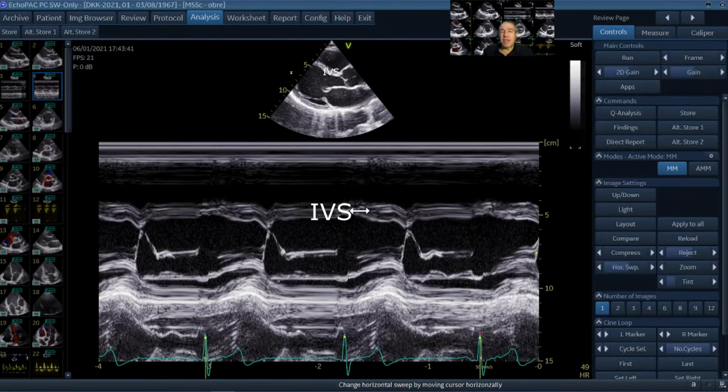You can nicely see the temporal behavior of the septum in end diastole, and then during systole the maximum contraction here. And below you see a part of the mitral leaflets, the anterior mitral leaflet, as it opens and closes again, and then it is closed, and we don't really see here the first opening of the valve. Looking at the dimensions, you can of course do the left ventricular dimensions also here in the M-mode, and that's the traditional view, as I told you.